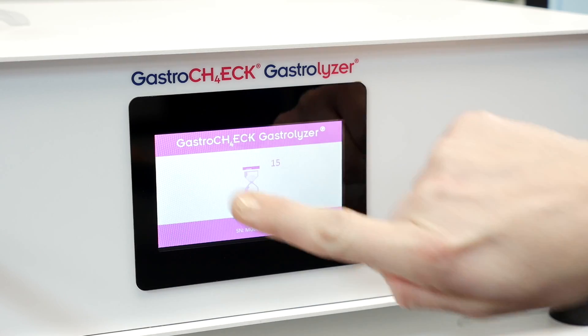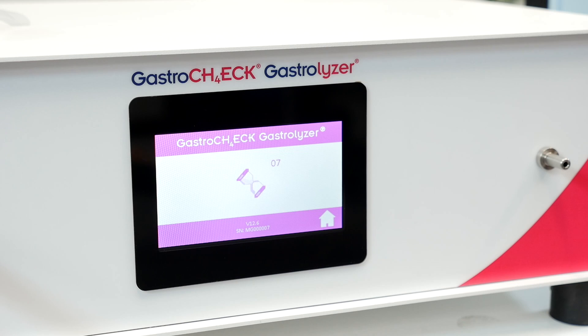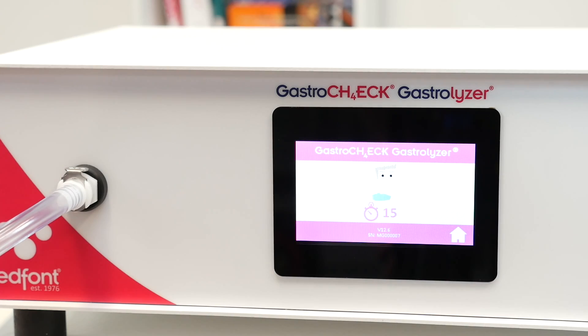Press the breath test icon to begin the test. If you are using the Gastro Chart software to record the results, press Capture Reading Now. An egg timer will be shown on screen while the sensor is zeroing. When prompted, inhale and hold your breath for the preset 15 seconds — the countdown will show on screen and beeps will sound during the last three seconds.